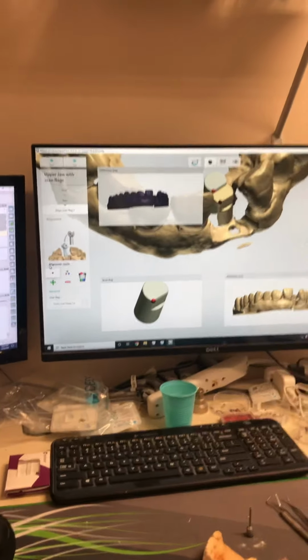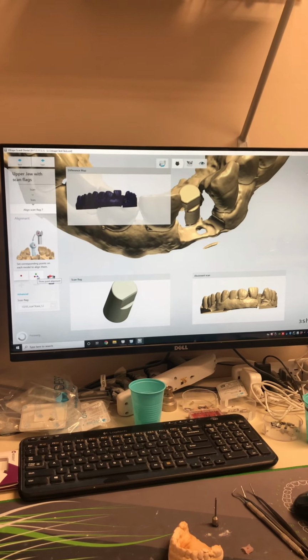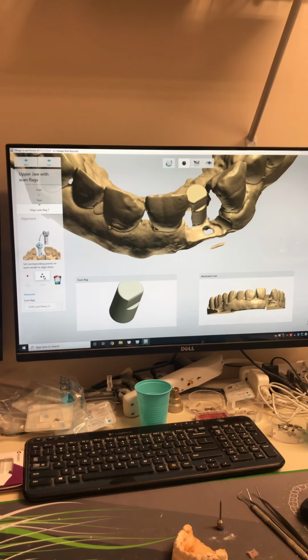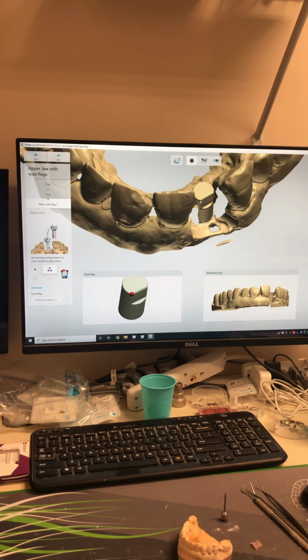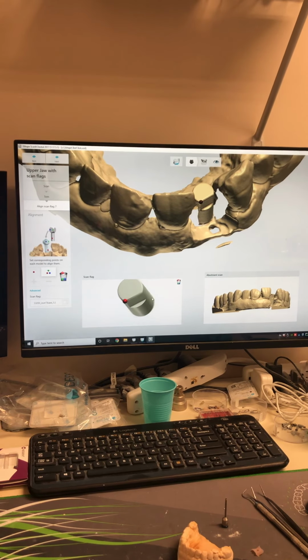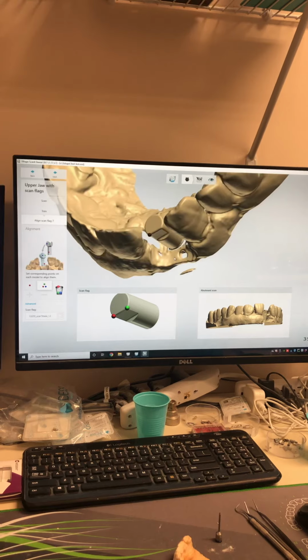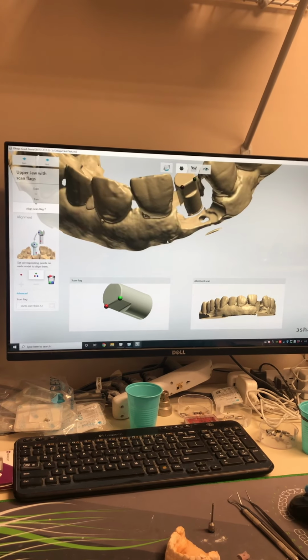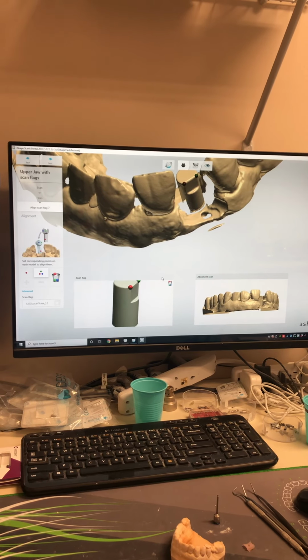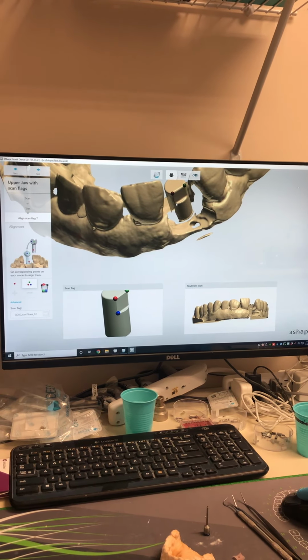So I've been using 1, so trash whatever you did before, use 3-point alignment. You pick one corner here, the same corner on the model, another corner on the model, and after that pick a point, maybe here, and the equivalent point on the model.